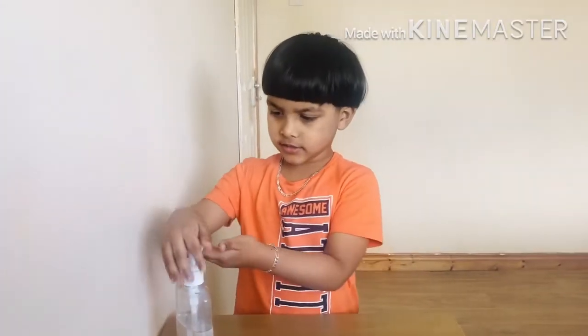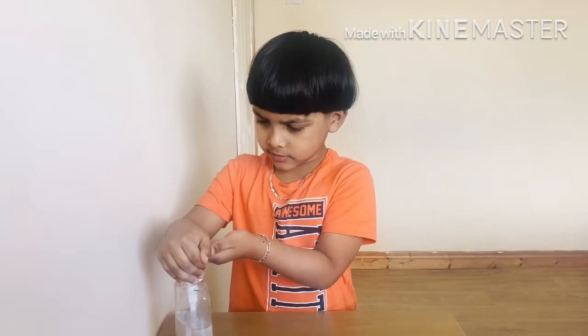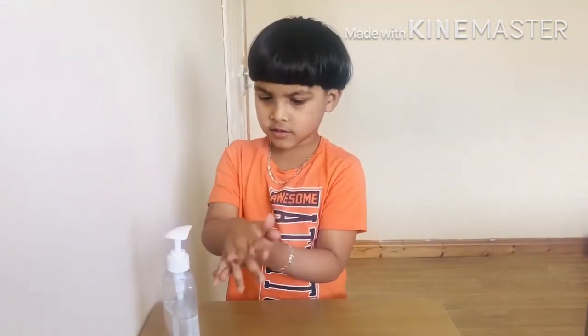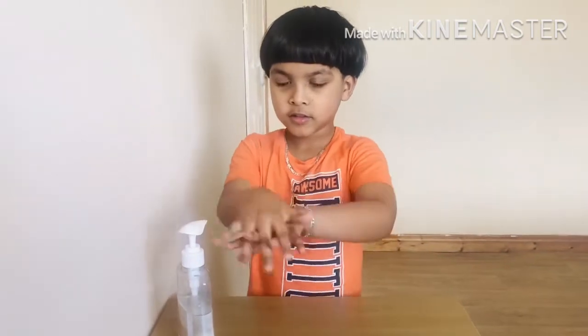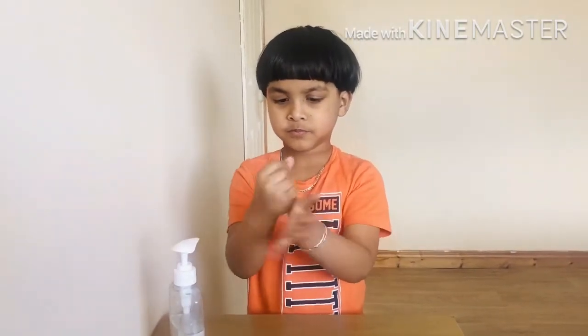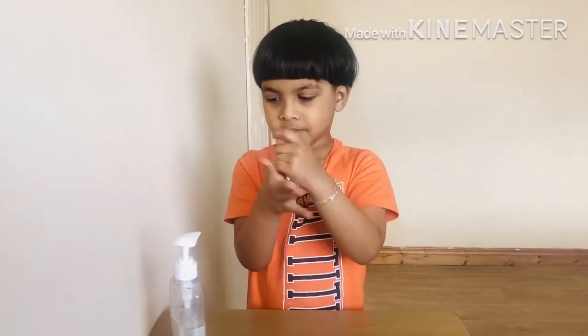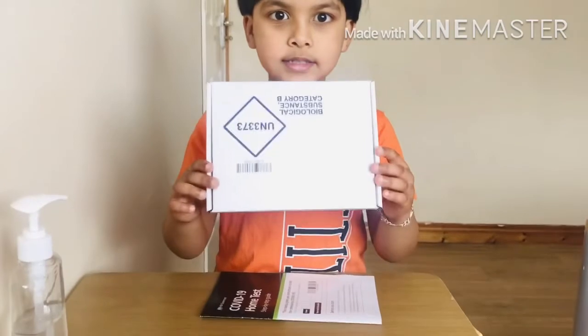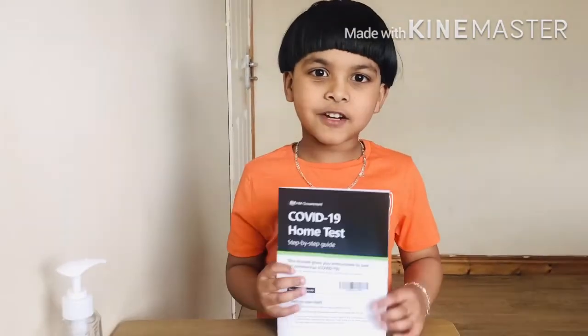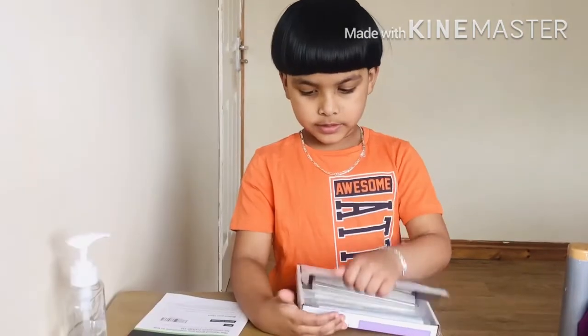First, we use sanitizer. Now open this — and this is the kit. You get one instruction book. And you open this kit.